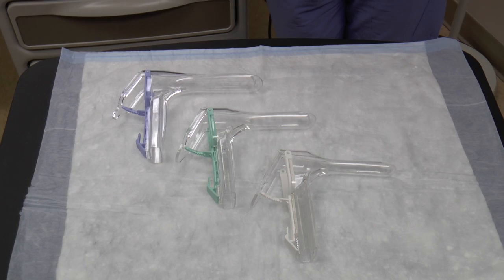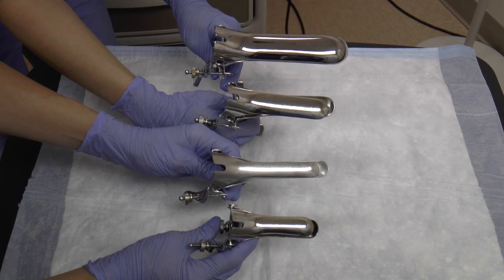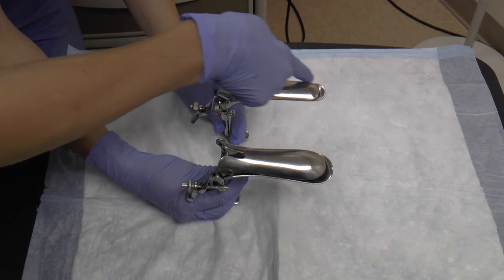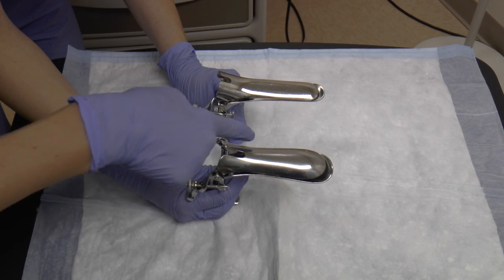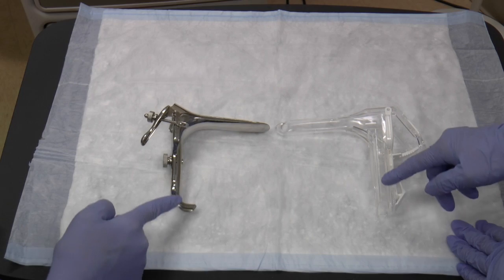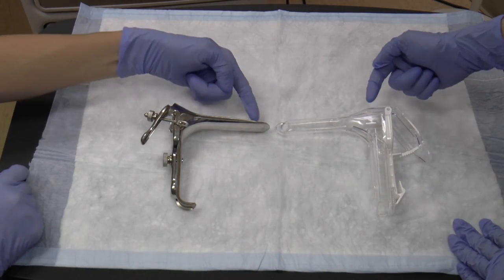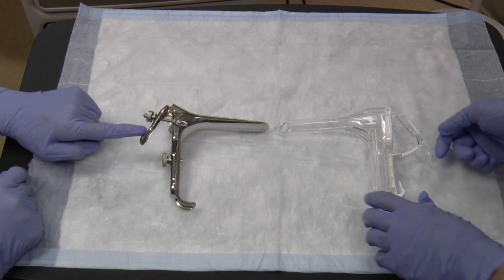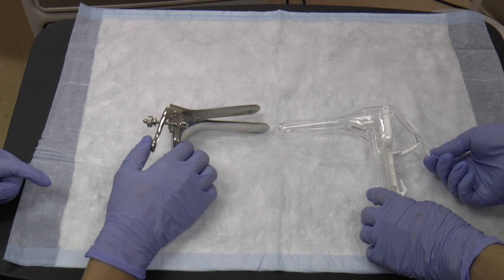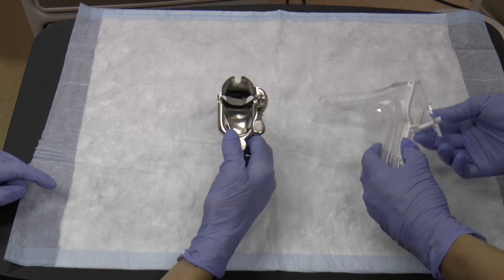The Peterson speculum comes in several sizes and can be plastic or metal. The Graves speculum has a wider bill than the Peterson and also comes in several sizes. Each speculum has a handle, a lower blade, an upper blade, and a thumb hinge. The lower blade is longer, is attached to the handle, and remains stationary. The upper blade is shorter and moves when you press the thumb hinge.